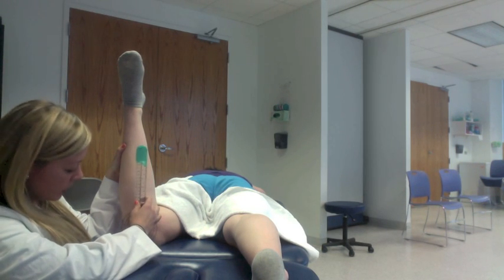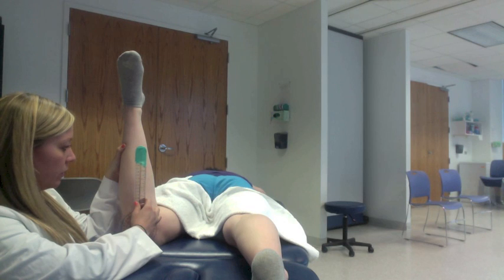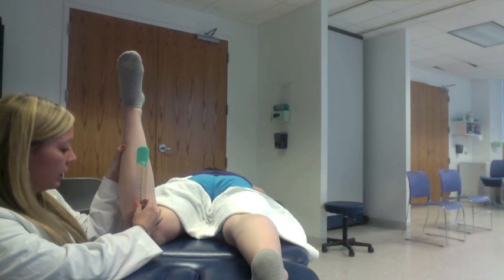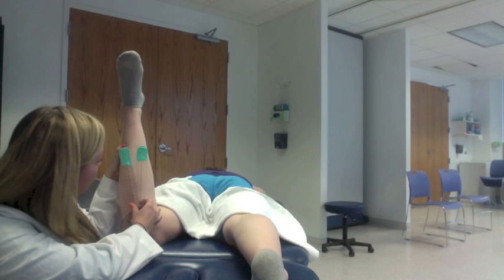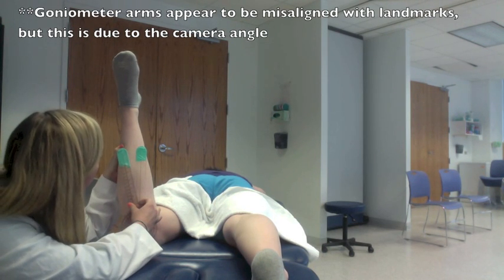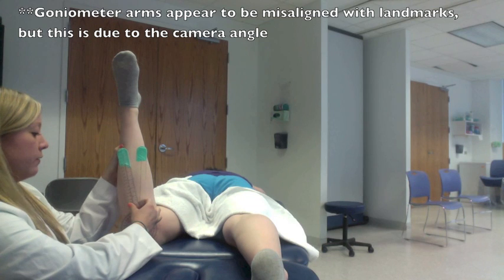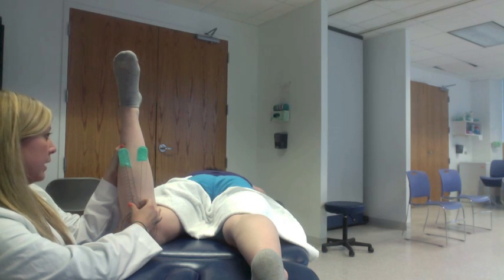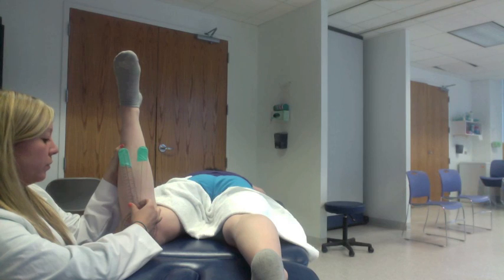The stationary arm is going to be perpendicular to the table, or vertical, and the movable arm is going to be the midline of your tibia. You are at 14 degrees right now, which is within normal limits — the 8 to 15 degrees of normal anteversion.